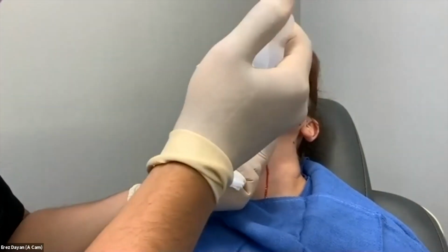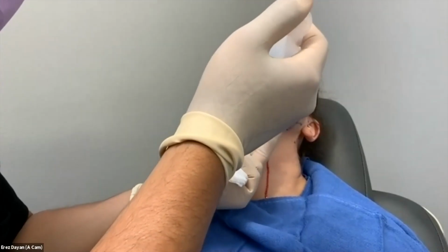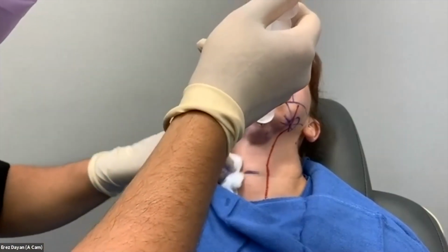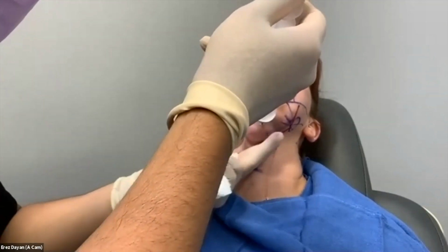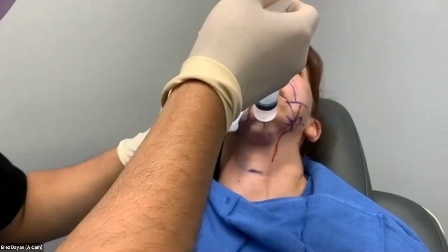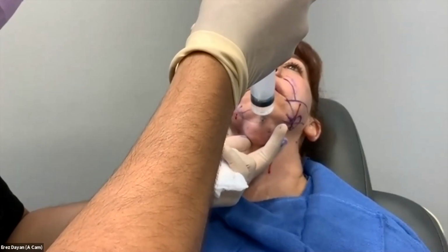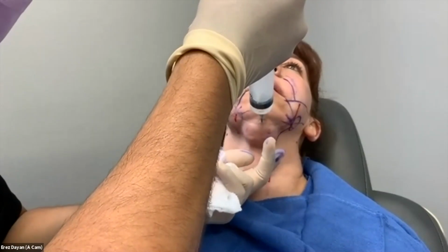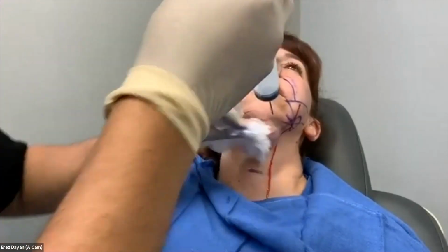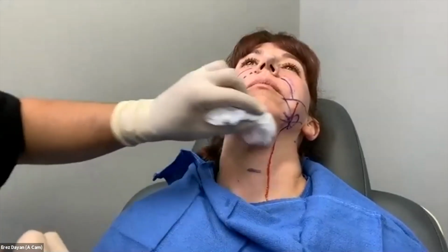Now in the neck, you want to be, again, in the pre-platysmal plane. Everything here is about being above muscle. So I don't want to see that peau d'orange kind of look. I just want to see how it's just filling. So that's kind of what I want. I just want a slow filling. The submental kind of bothers people most because it's a little unnatural pressure. You feeling okay? Okay. So again, I usually tumesce a little more than the average. But see, the nice thing about this is now I have an access point at each of these places.